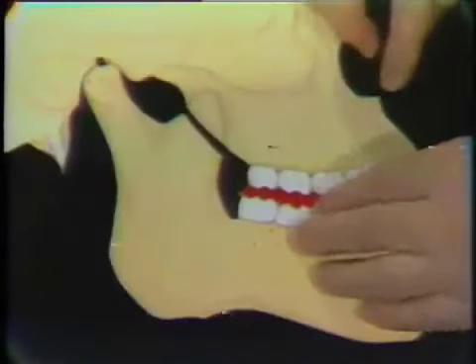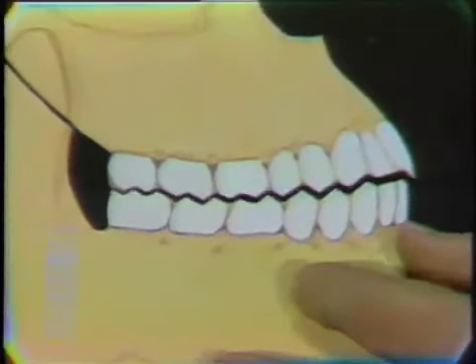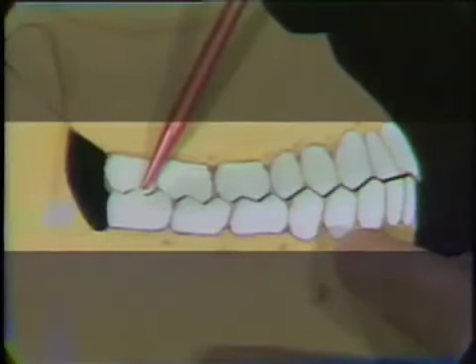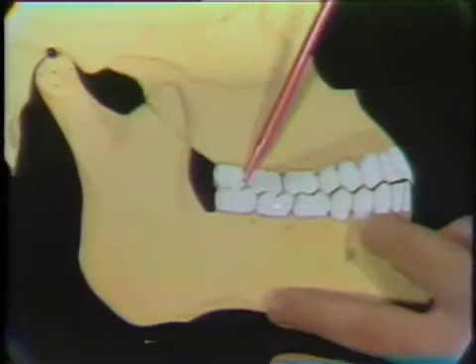So now, if we remove the centric registration and we close the teeth into contact, we would find an error in the way the teeth come together. We would see that we would have a contact in the posterior area and an open area in the front part of the mouth. And the opposite would occur if we erred below the true hinge axis. We'd have a contact first in the front part of the mouth and an open contact in the posterior part of the mouth.